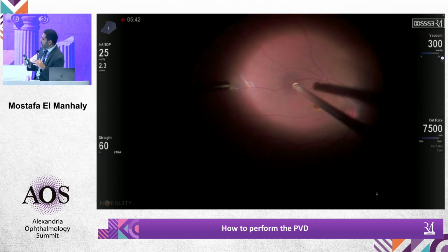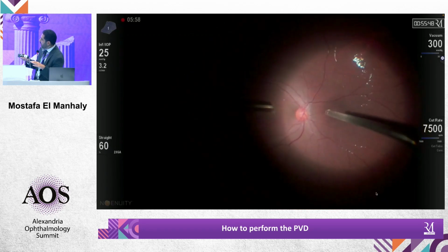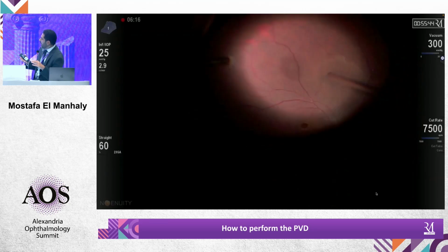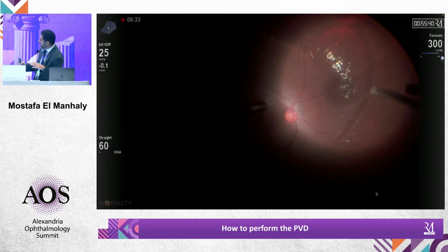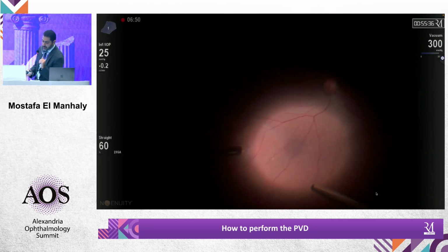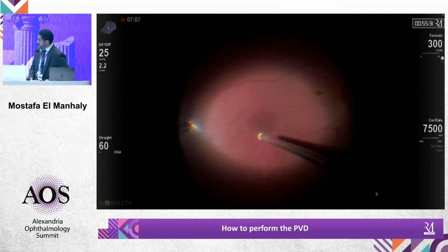Okay, but I mean that sometimes there is a discrepancy between the wave that is going on the retina and what you have in the port of the cutter. So which one do you feel that you are moving and propagating the wave? The one on the retina, the enlarging one over the retina, or the one that you have in the cutter? The enlarging one over the retina, and then I restain again, probably with triamcinolone, to check if there is vitreous cortex again.